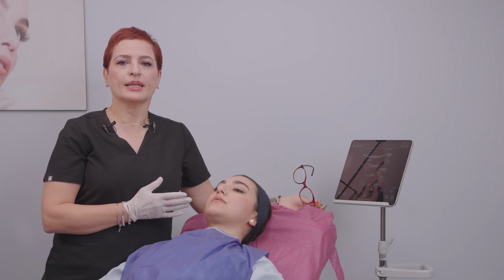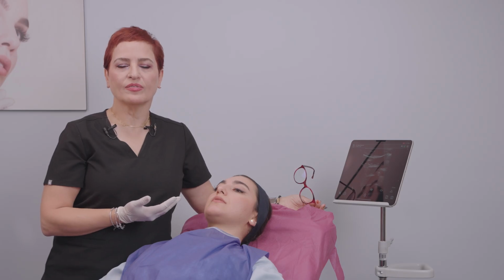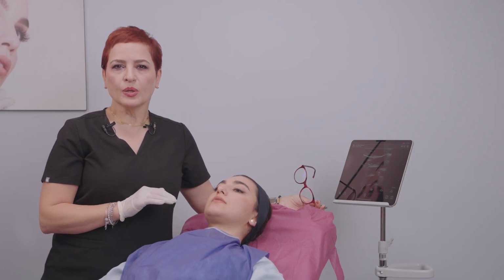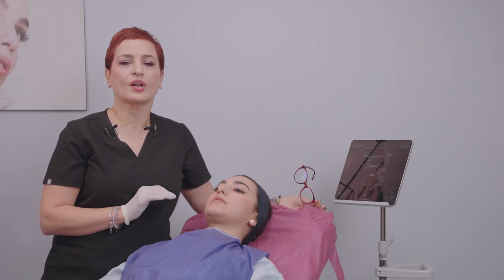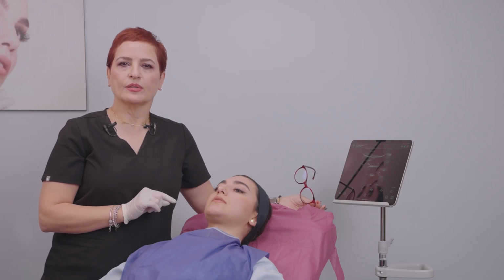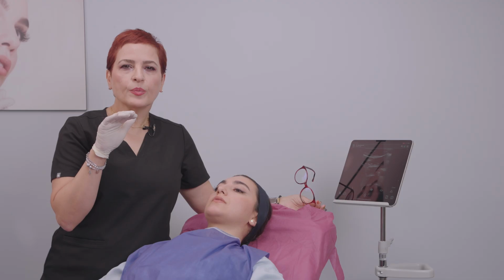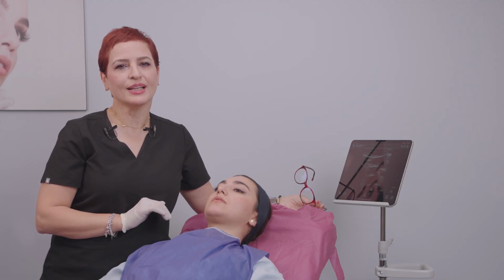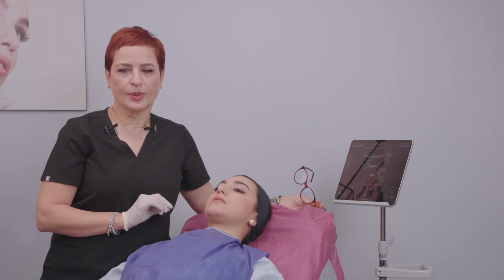Then medially and below, the deep part of the buccal fat pad is the buccinator muscle. The superficial part is either the parotidomasseteric fascia or the risorius muscle, and sometimes we can find a parotid duct on the uppermost part of the fat pad and the facial vein in the lateral part of this fat pad.